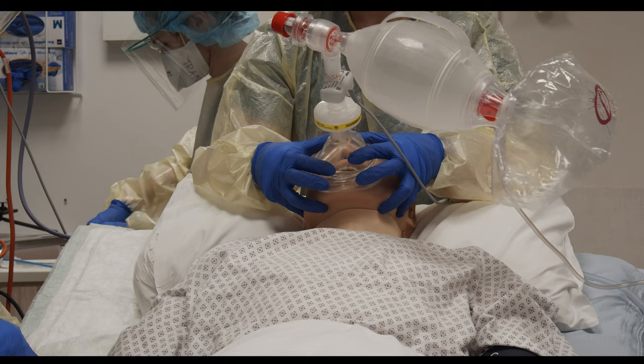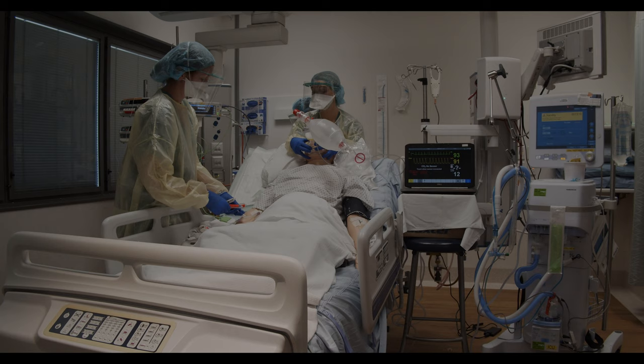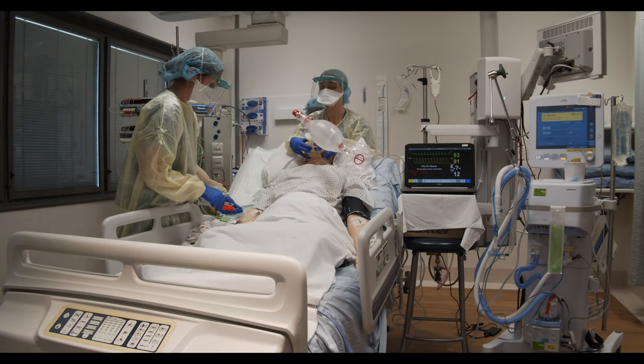The patient should then be pre-oxygenated with a good two-handed seal over the face mask for approximately 3 to 5 minutes, aiming to achieve the best possible saturations prior to induction. Okay, so saturations are 91. Cool. Are you happy? Yeah, happy that checks pass.